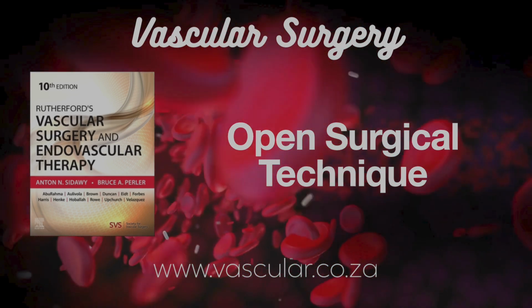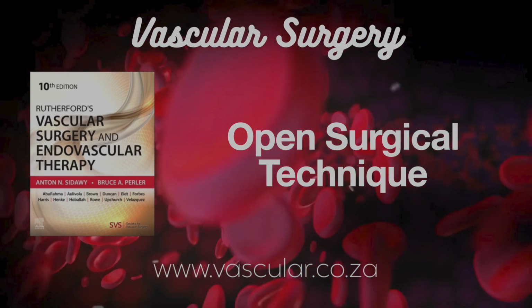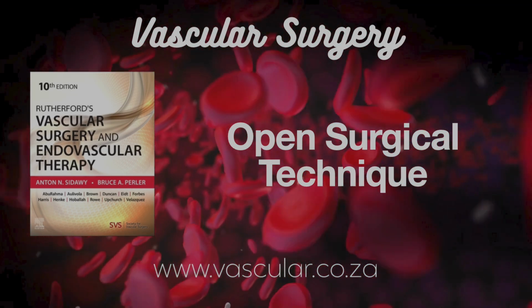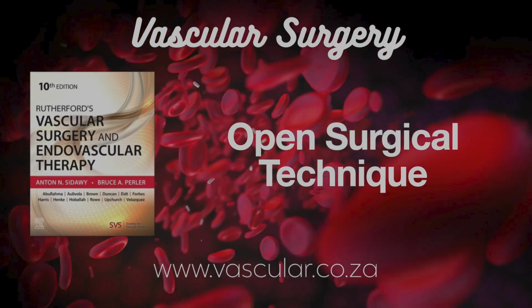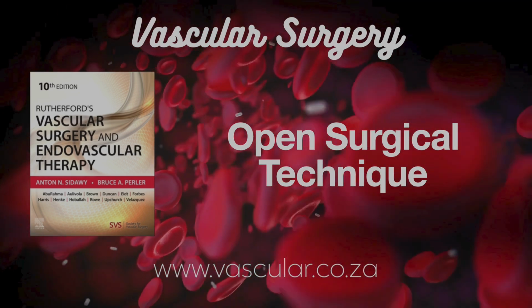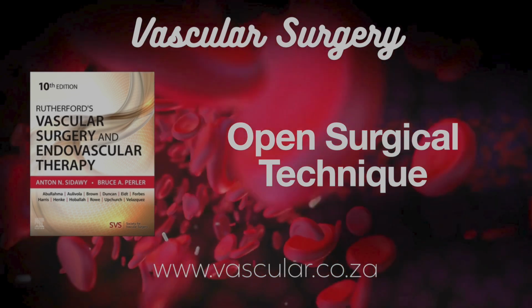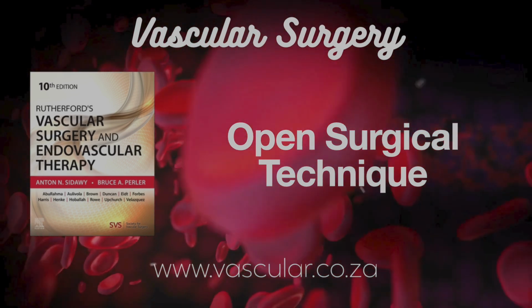You mentioned fluoroscopy, X-ray guidance. How does that help? It's a valuable tool, used from the start or selectively. You can see the balloon inflate, do an angiogram first for a roadmap. See the anatomy and the clot. Exactly. Watch the catheter move, know exactly where it is, see if it goes down a side branch. Judge inflation needed by watching the balloon fill under fluoro.